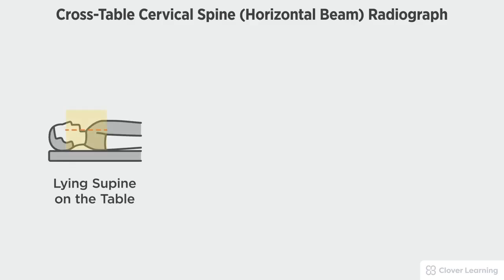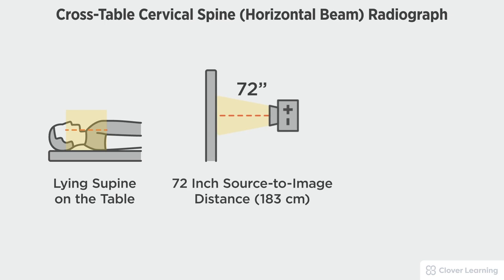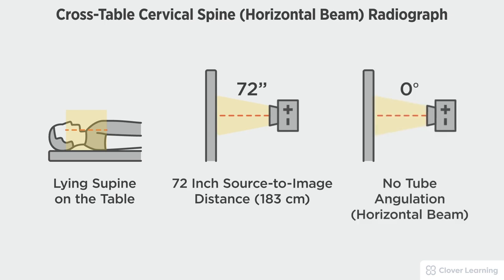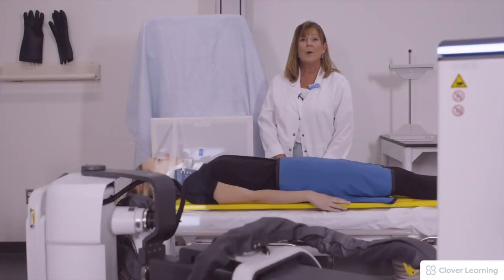In this view we will be demonstrating the cross-table lateral cervical spine using a horizontal beam. The cross-table lateral cervical spine should be performed with the patient lying on the table using a horizontal beam with a 72-inch source to image distance and no tube angulation.